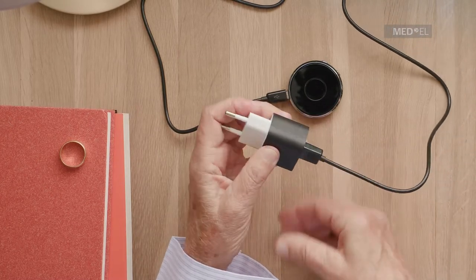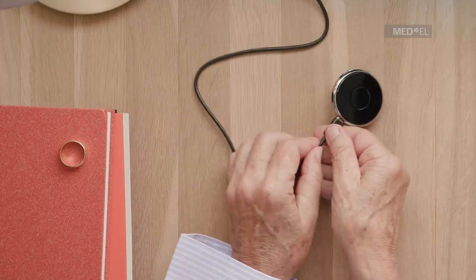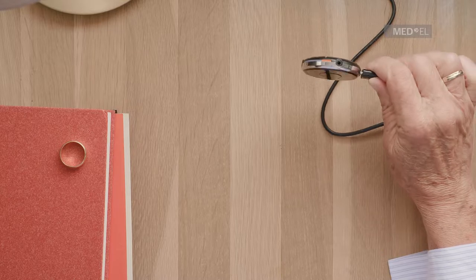The orange LED will be illuminated during charging. When the green LED turns on, Samba2Go is fully charged. This takes around 2 hours.